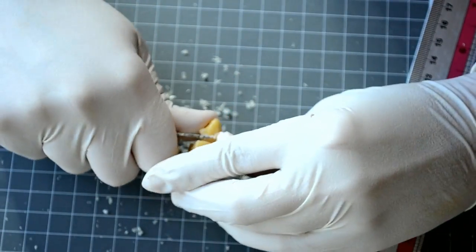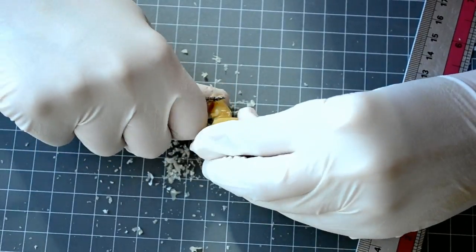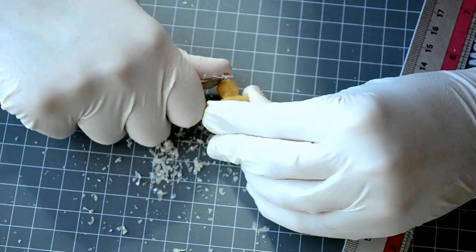Now, use your Lecron carver to carve the distal and mesial sides of the temporary cingulum until you form a prominent cingulum.